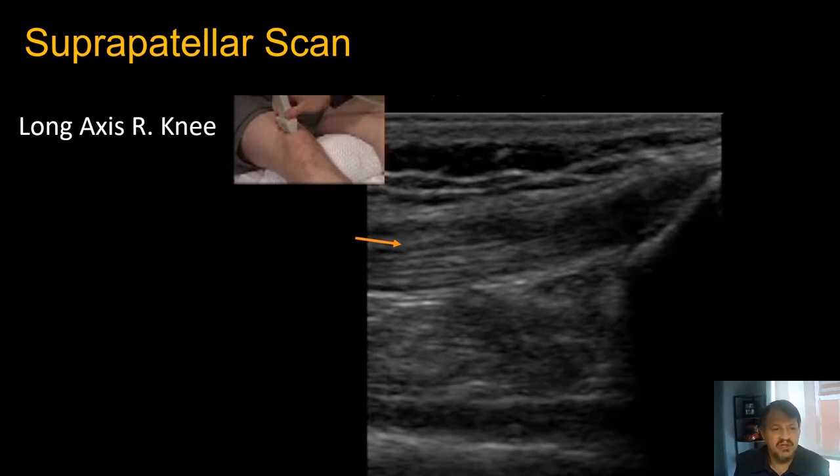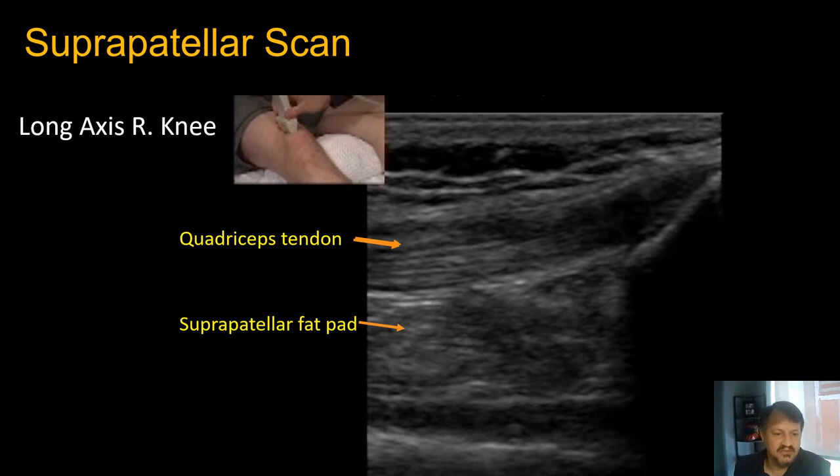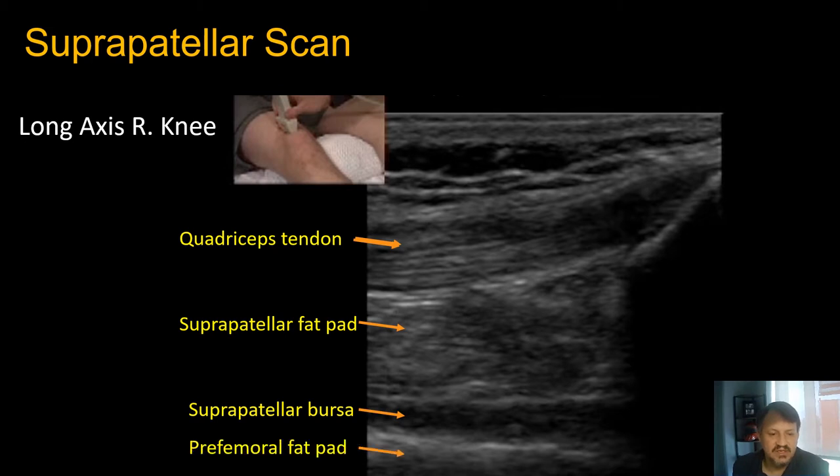In this still image long axis scan, the probe marker is towards the patient's head. On the leading edge we have the patellar or quadriceps tendon, which is continuous with the patella inserted in between. Then we have the suprapatellar fat pad, the suprapatellar bursa which is our target — this one has a bit of effusion — and the pre-femoral fat pad just above the femur. The patella has a characteristic sound shadow that drops off like a cliff below it.